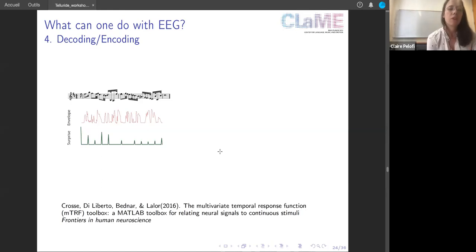The one thing that I didn't mention earlier is that when you do decoding, you can look at very stimulus-driven low-level features such as the envelope, but you can decode potentially anything that is structurally meaningful, however abstract. In this case, we were wondering how well you can decode musical syntax or musical expectations from the brain of people. So we applied TRF. We first had people presented with some musical stimuli, and I'm going to play you an example right now. There were Bach monophonic arrangements.